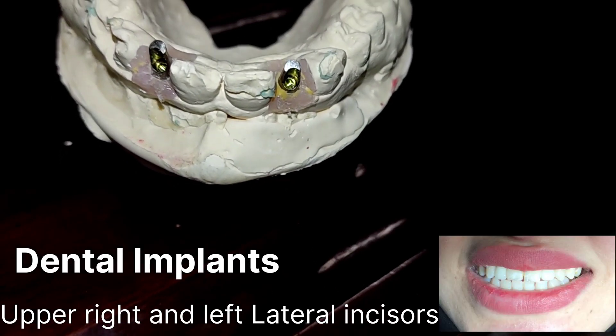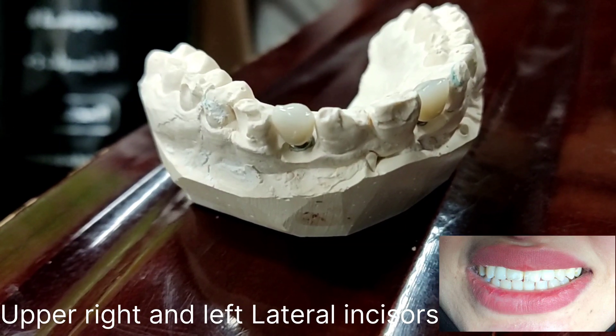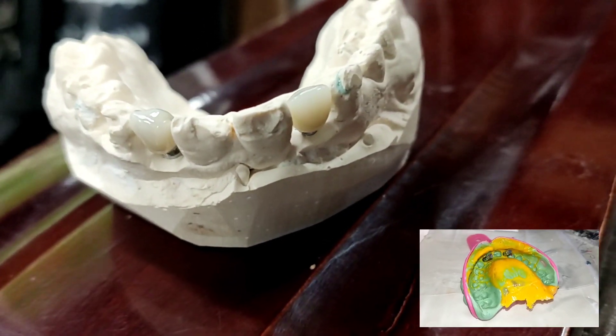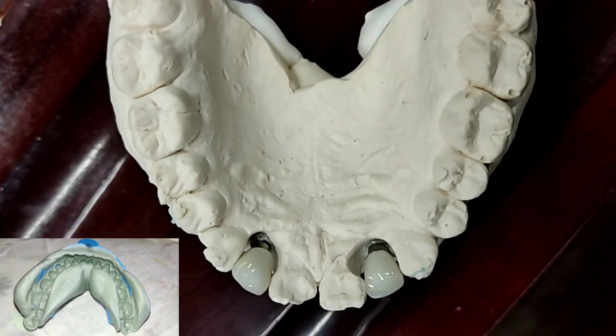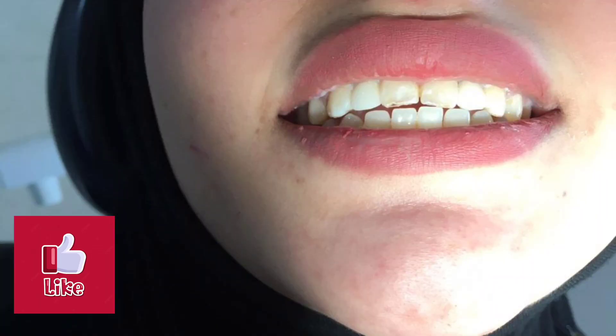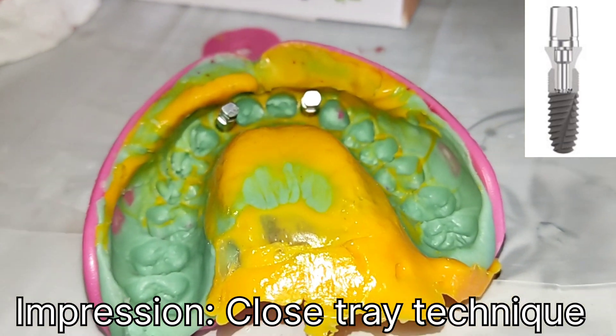Good day everyone. New video about dental implants — a clinical case at Dental Clinic, Dental Implant Prosthodontics. Close tray impression prosthetic part of dental implant after surgical insertion of fixture of upper left and right lateral incisors. Dental implant screw was tested for the stability of fixtures, and in this video we cover the second step of dental implants.